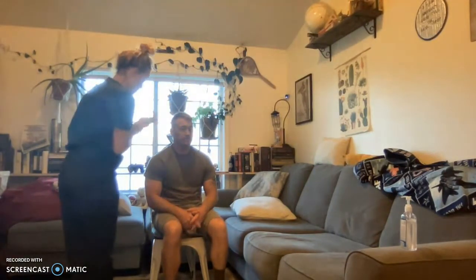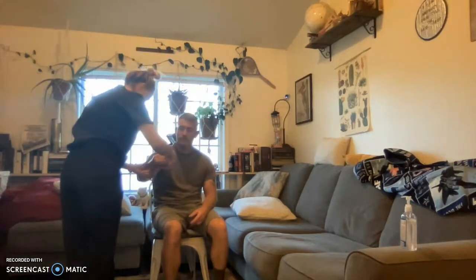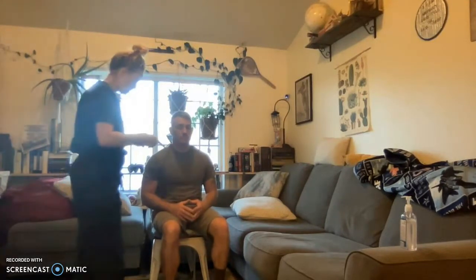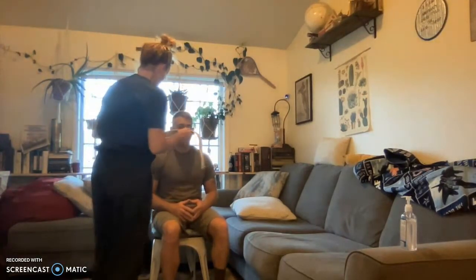Hi, my name is Emily. Can I see your wristband? Can I have your name and date of birth? I am here because I want you to get up and take some steps around just to get some exercise. I brought the gait belt — that's just to ensure your safety and stability. Is that okay if I go ahead and put it around you?